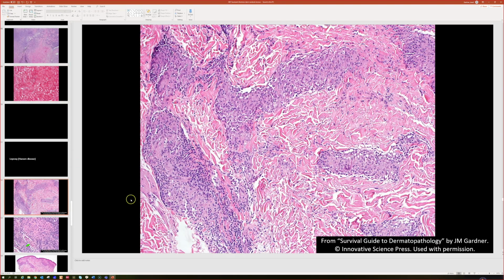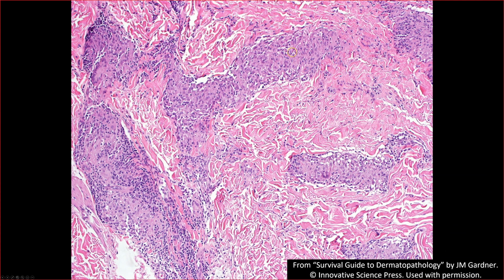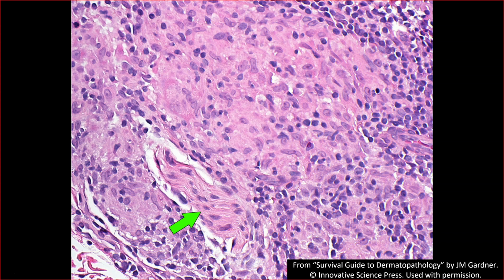And here, let me show you a couple examples. This is an example of tuberculoid leprosy. The granulomas are much more obvious here, and the cells are linear or serpiginous because they're tracking along neural structures and around vessels too. And they tend to have much more dense cytoplasm, less of that loose, fluffy cytoplasm like you see in lepromatous leprosy. They're almost sarcoid-like granulomas. Here, there's a nerve right here, and a sarcoidal granuloma wrapped around the nerve.